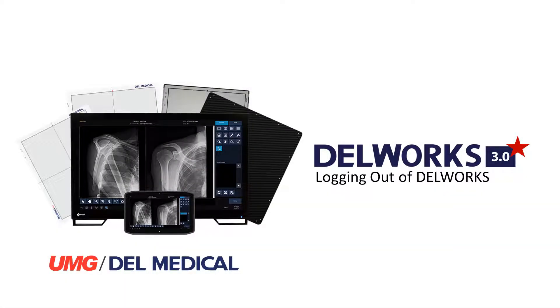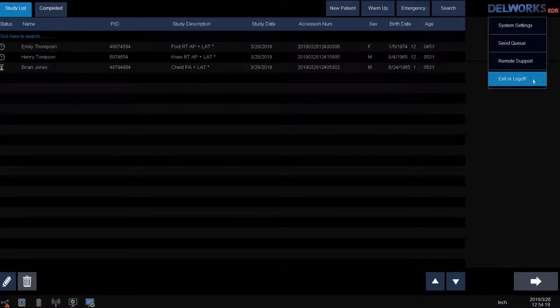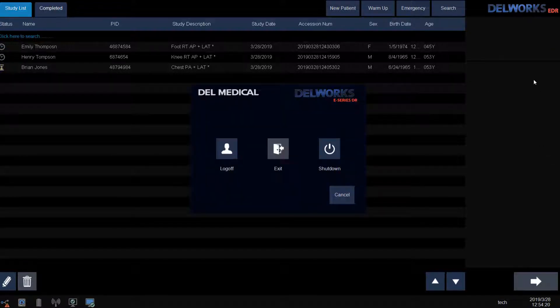Logging out of DellWorks. To log out or to shut down DellWorks, from the study screen select the DellWorks logo, then select Exit or Log Off, and then choose Log Off or Shut Down.